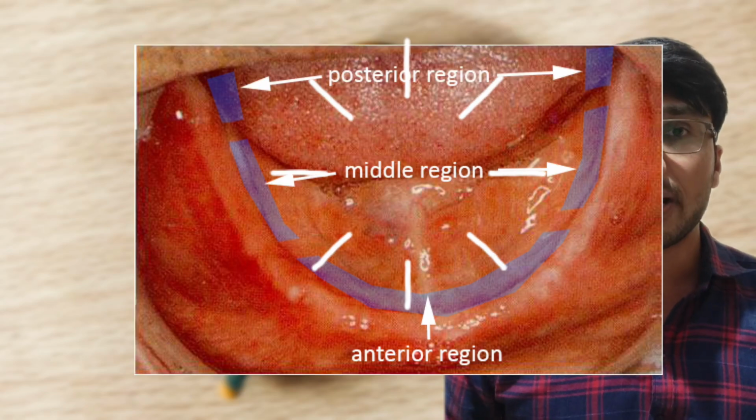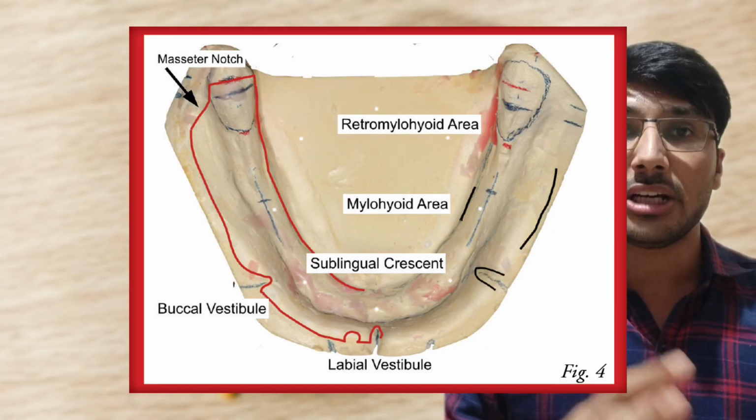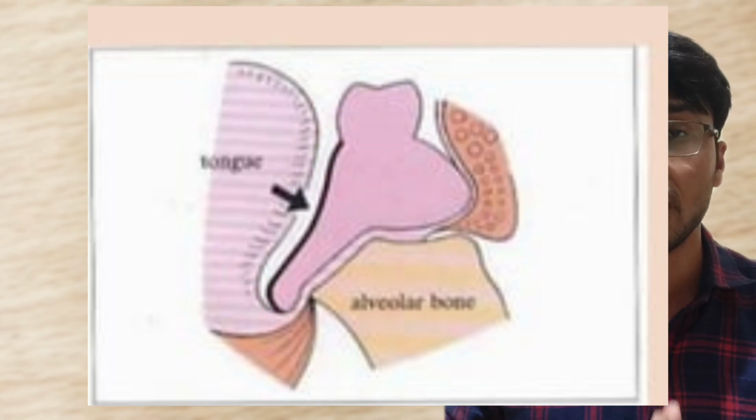The second area is the middle region. This part extends from the pre-mylohyoid fossa to the distal end of the mylohyoid ridge, curving medially from the body of the mandible. This curvature is caused by the mylohyoid ridge's prominence and the mylohyoid muscle's action. When the middle of the lingual flange is made to slope toward the tongue, it can extend below the level of the mylohyoid ridge. In this way, the tongue rests on the top of the flange and aids in the stabilization of the lower denture on the residual ridge.